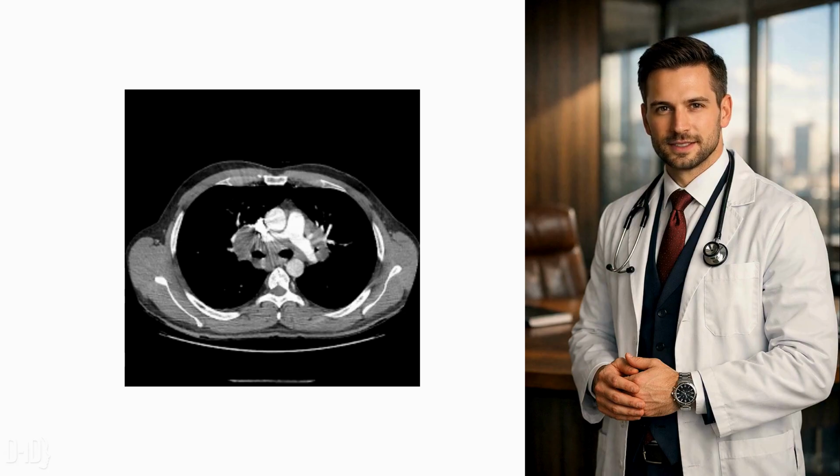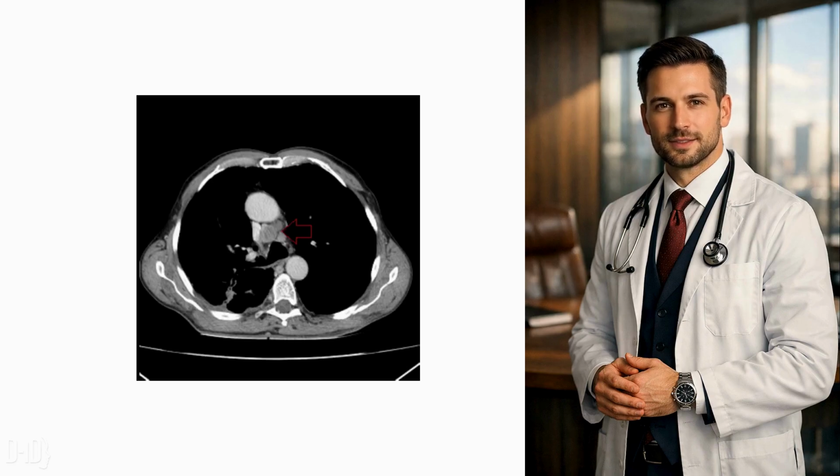Meet Sarah, 35. Dry cough, fatigue. CT shows symmetrical, potato-like hilar nodes. It's not lung cancer. This, my friends, is classic sarcoidosis. It's a granulomatous disease that mimics malignancy, yet it's entirely different. Other suspects here? Tuberculosis, histoplasmosis, or pneumoconiosis.